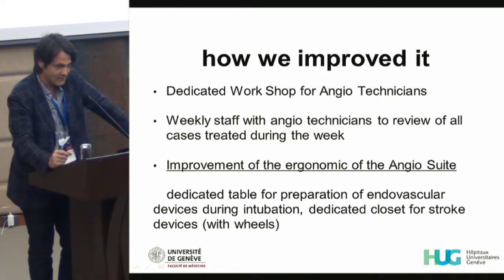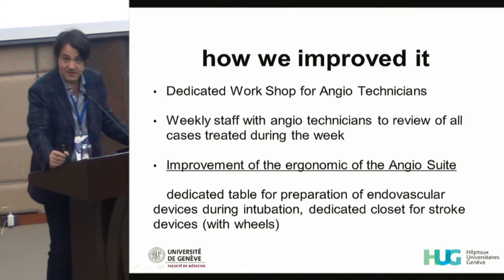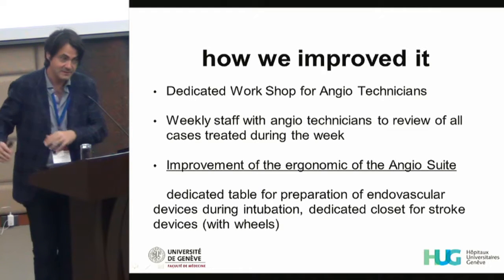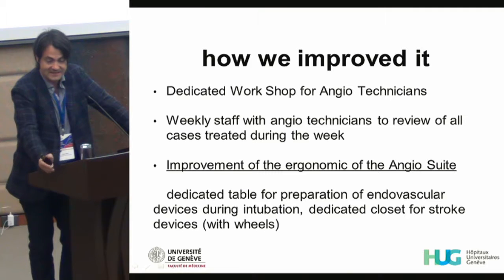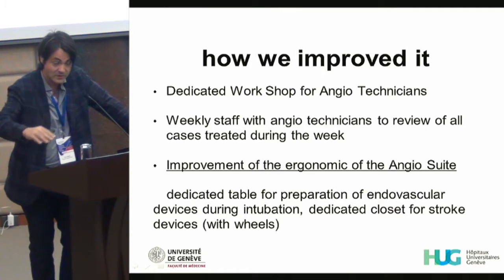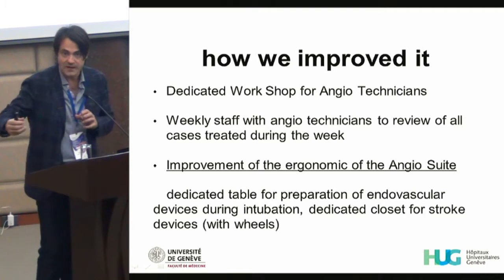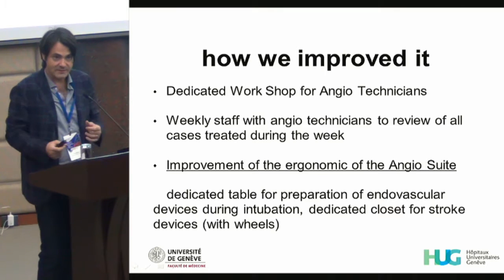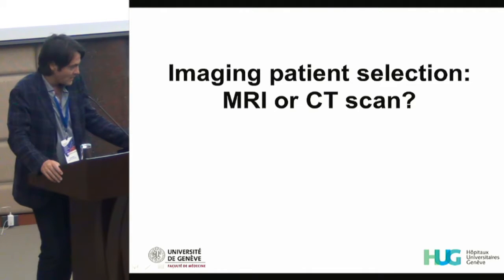And we also have a closet with wheels, because we put all stroke thrombectomy materials in that closet, and technicians know that they just have to take this closet. Even though we work in different angio suites which are far away from one another, when we move to the other angio suite they are prepared and can easily go ahead.